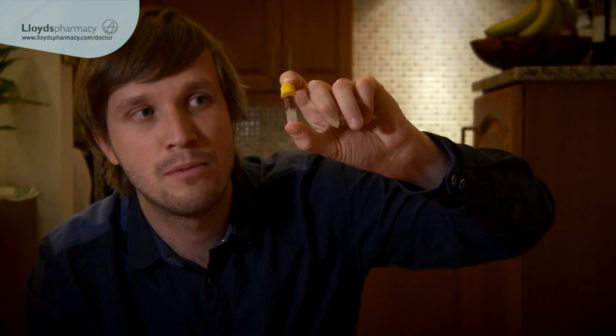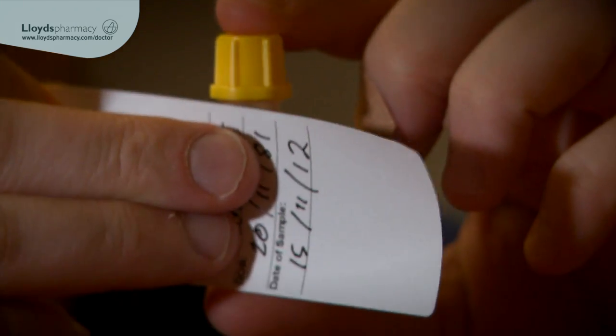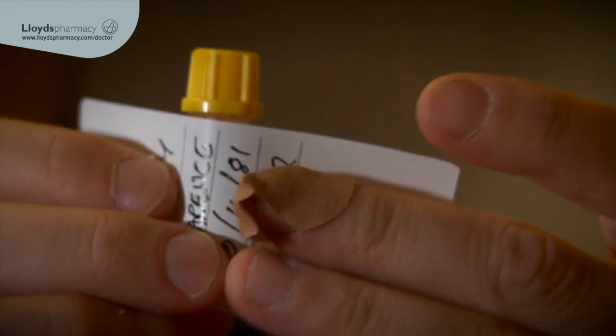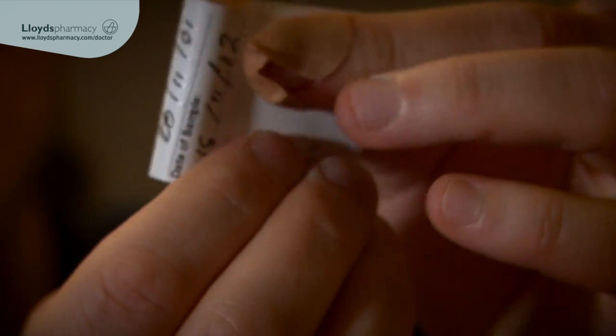Now I just invert the bottle between 5 and 10 times to make sure the blood is mixed up. And then I have to put the label on it. You just place the label on the bottle and squeeze it at the side.